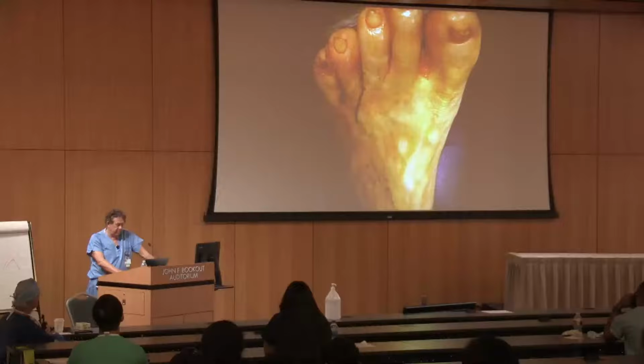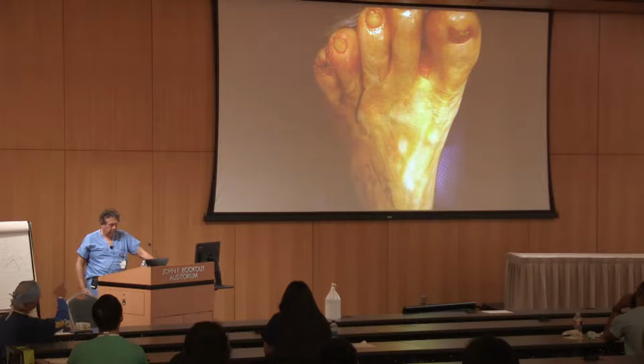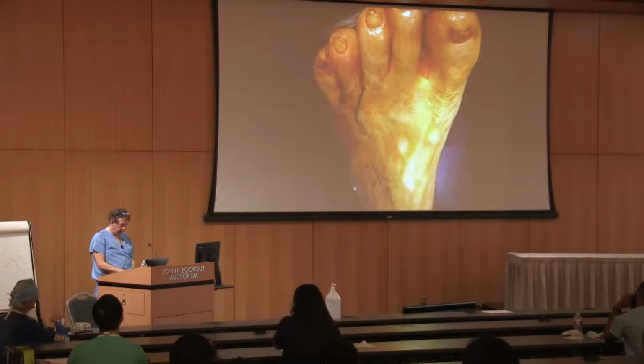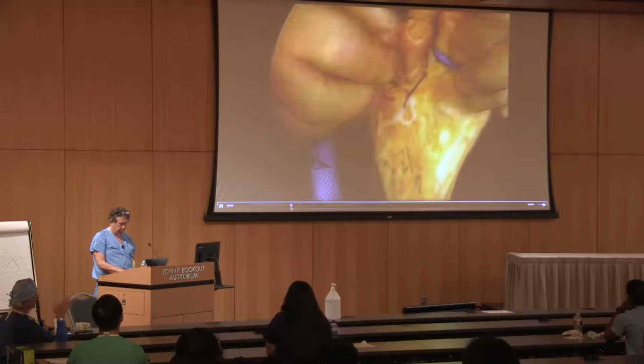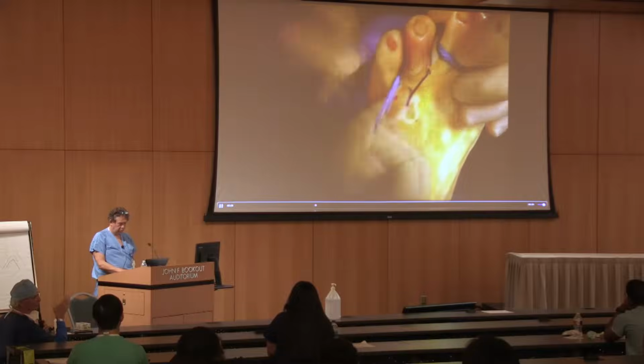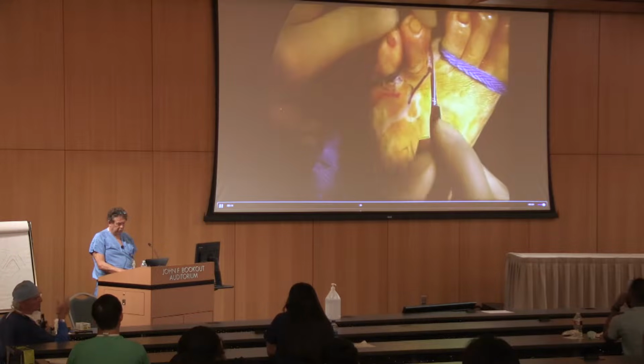Okay, this is a ray, a little more complex. You can see that the handle of the racket is oriented longitudinally along the metatarsal, and you can extend that as much as you need to. The length of the handle doesn't have much to do with the danger. There's no harm in having a longer handle because it's going to close easily. And so it really is a teardrop shape. And again, try to keep the blade perpendicular to the skin. You see how he's rotating the blade to do that.